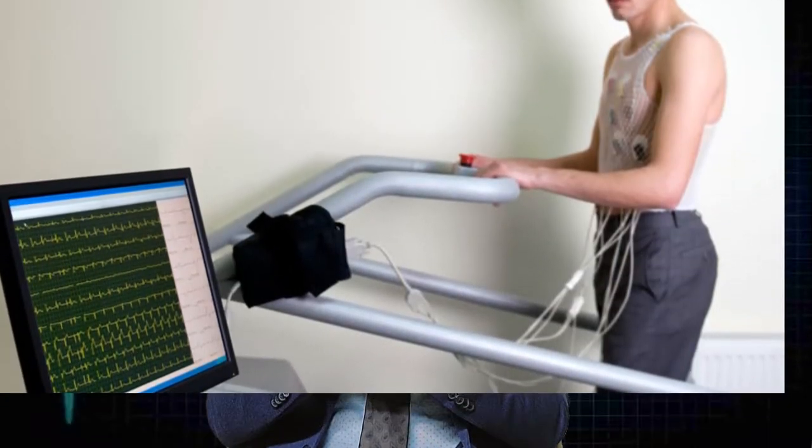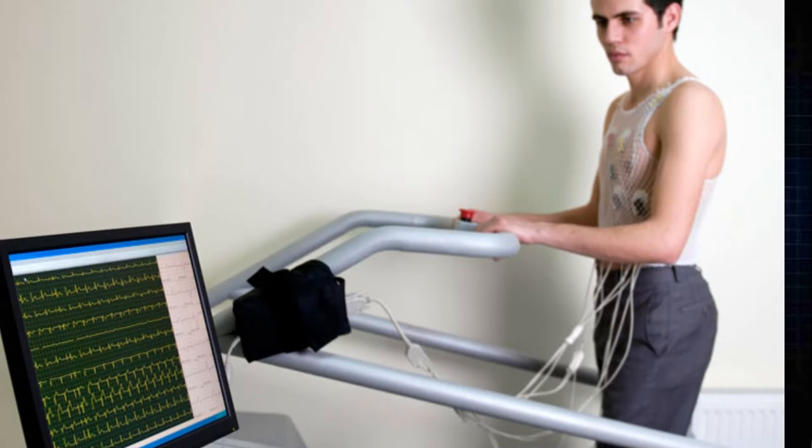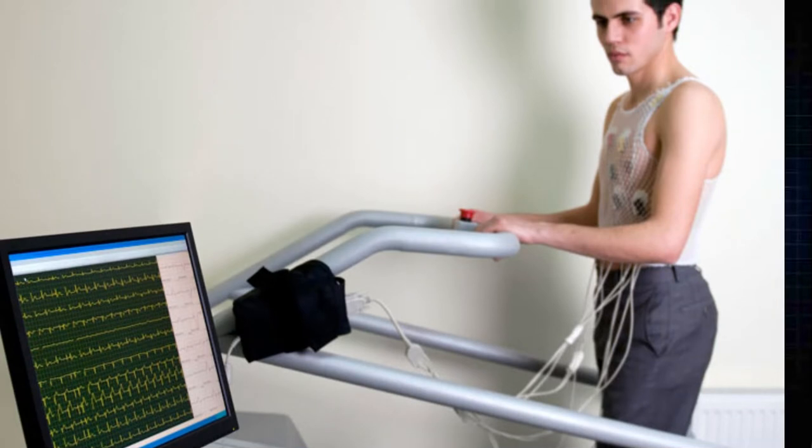Specifically, we will discuss what is a positive, negative, or inconclusive treadmill test, when do we consider it positive, when do we need to do an angiography, what are the different types of responses such as hypertensive and hypotensive response, and chronotropic competence assessment.